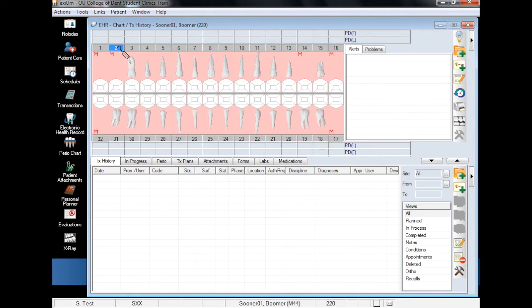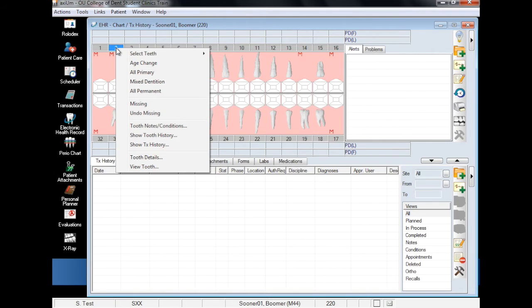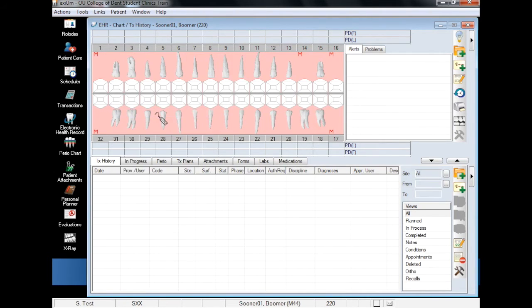If you ever mark a tooth as missing by mistake, select the tooth number that you would like to restore, right-click, and choose Undo Missing.